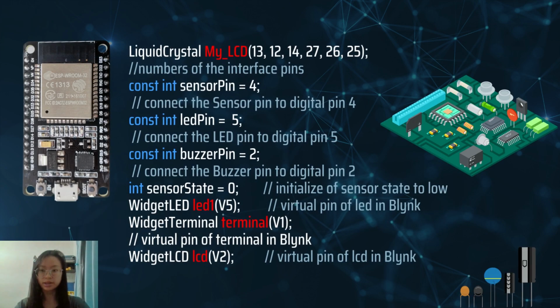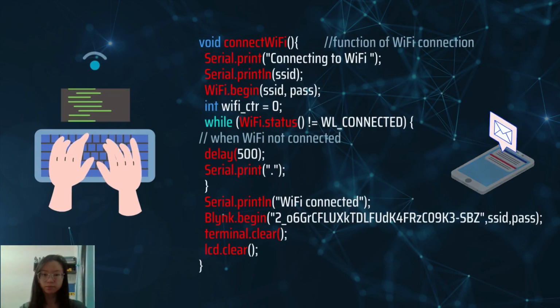The code shows that the number of interface pins of LCD at 13, 12, 14, 27, 26, and 25, while sensor connect to pin 4, LED pin to 5, and buzzer pin to 2. The variable sensor state is initialized to 0. The next 3 lines create virtual pin of BLINK for an LED, a terminal, and an LCD display.